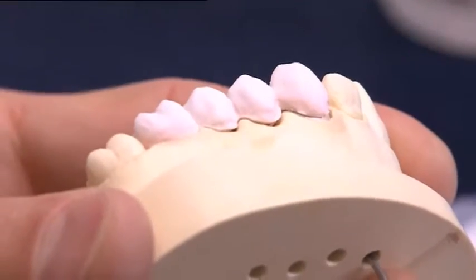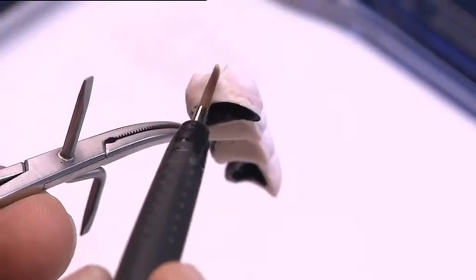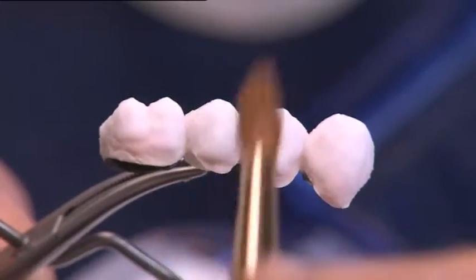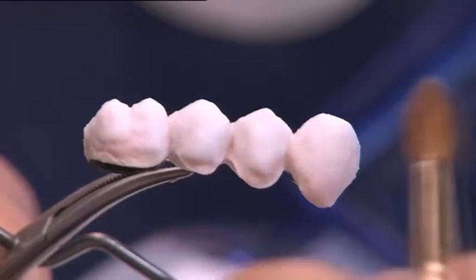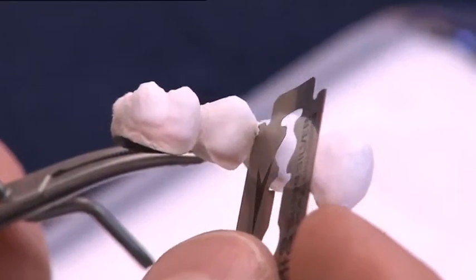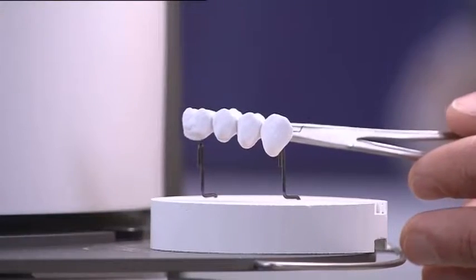After carefully lifting the bridge from the model, the contact points are supplemented with dentin and incisal material. The ceramic surface is densified by running a large dry brush over it, which will reduce a retraction of the ceramic in the cervical margin. The layered bridge is separated in the interdental areas using a sharp instrument in order to control the volume shrinkage of the ceramic.